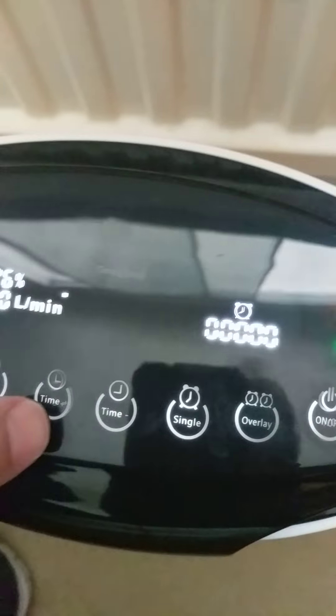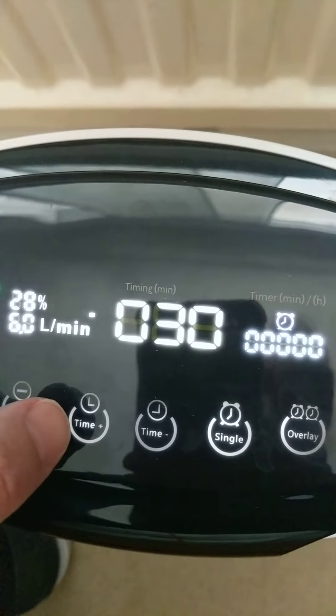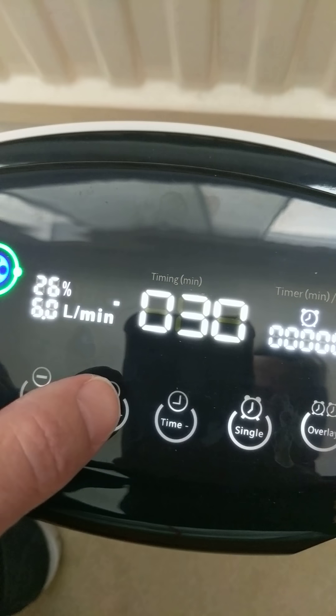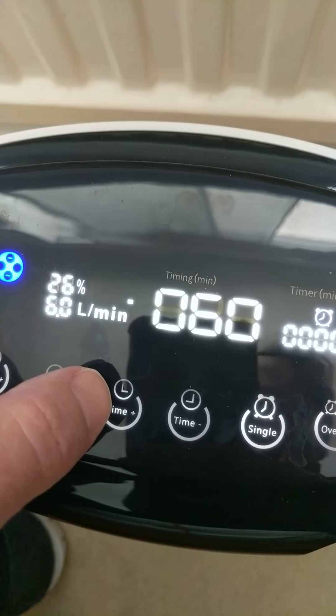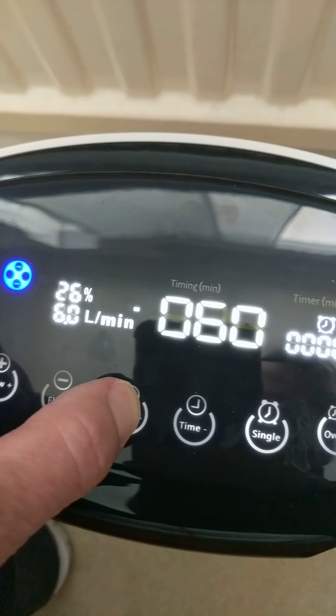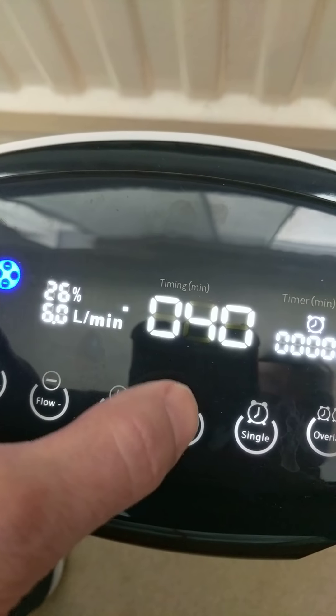There is a timer, so that will turn off in 30 minutes. If I press the timer again it goes in 30-minute increments, and if I hold down plus it goes in five-minute increments. And then it goes down.